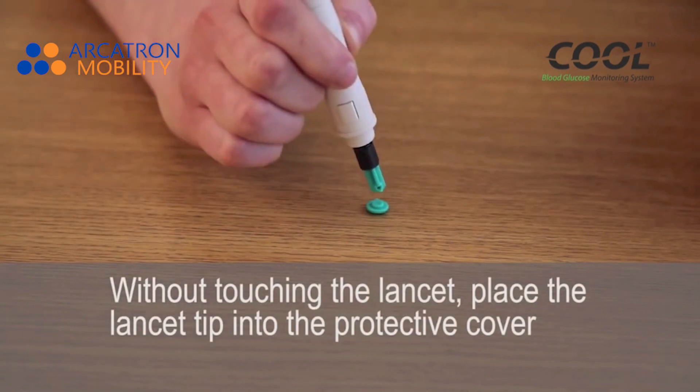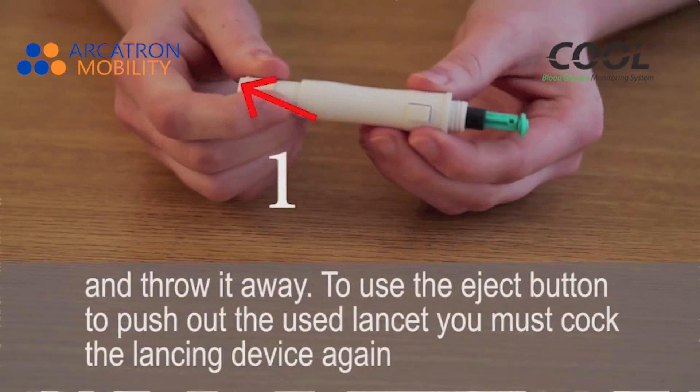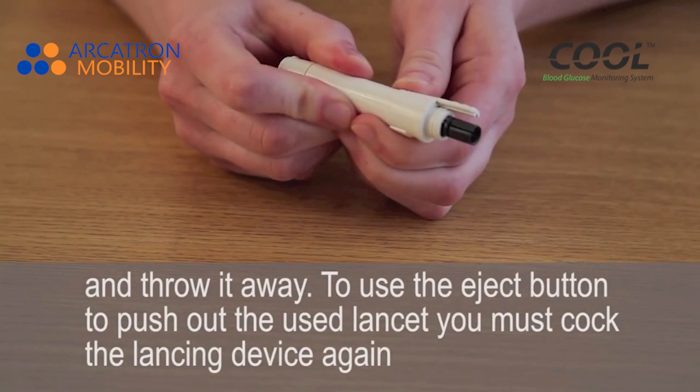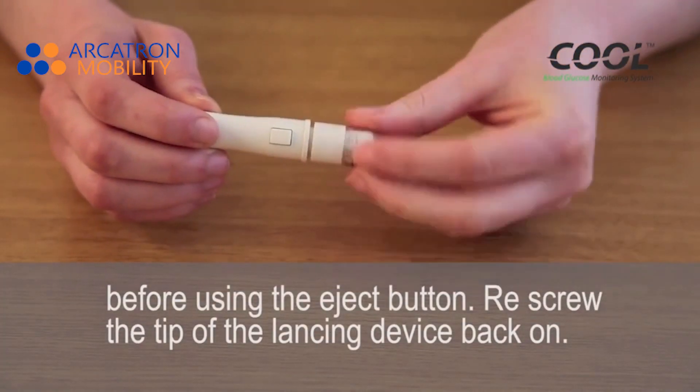Without touching the lancet, place the lancet tip into the protective cover and throw it away. To use the eject button to push out the used lancet, you must cock the lancing device again before using the eject button. Re-screw the tip of the lancing device back on.